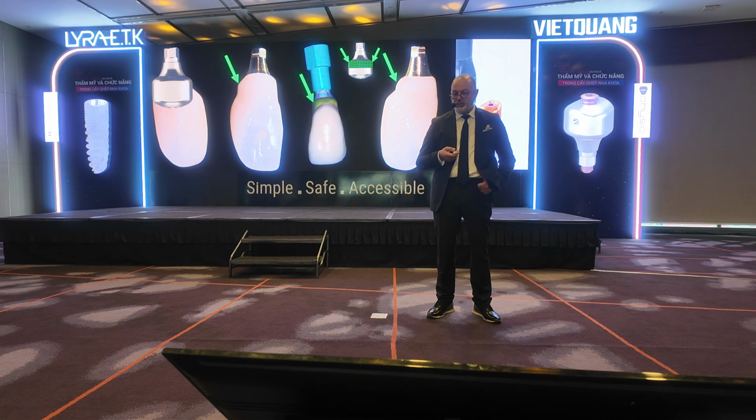How we proceed: we will remove the short screw and put the long screw in order to scan. But this short screw will give the possibility to have an internal piece for the provisional without being cemented.